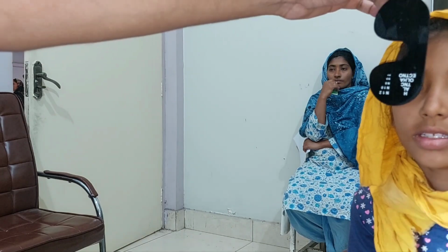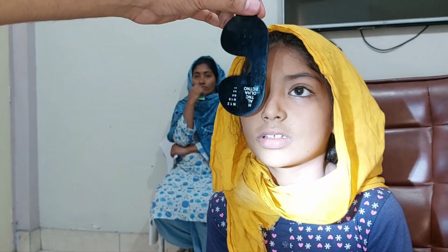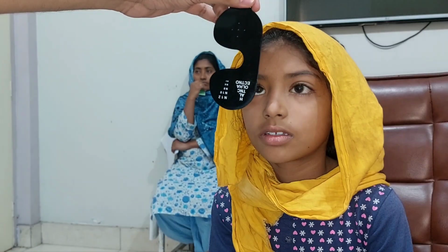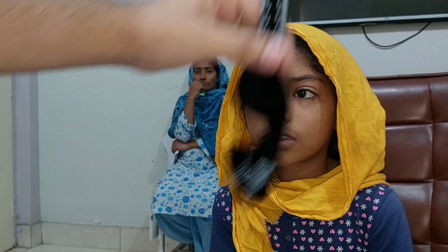Okay. So this is the right eye coming from up down. What about the left eye? Do the alternate cover test. So the right eye is coming from above down. So that is hyperdeviation. And the left eye is going from inwards to the primary central position. Okay. So you have done it for far target. Now do it for near target.